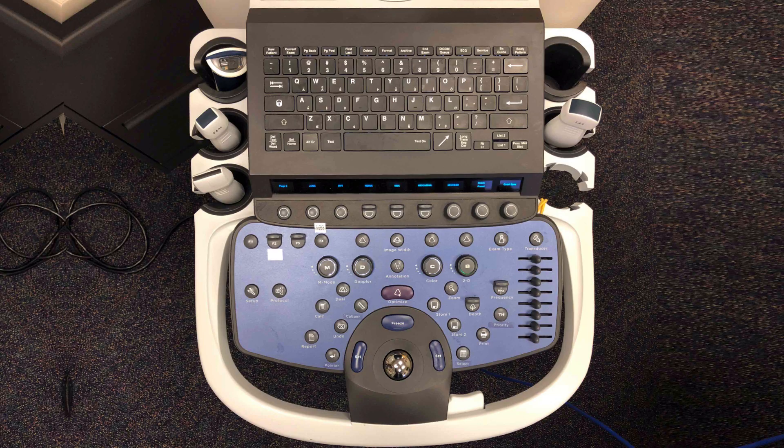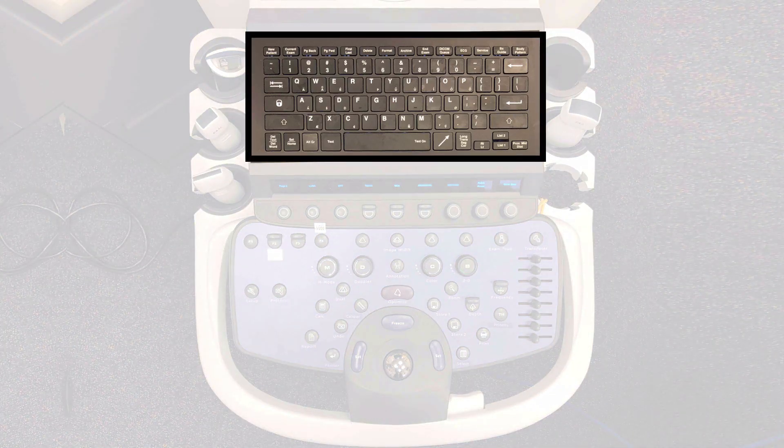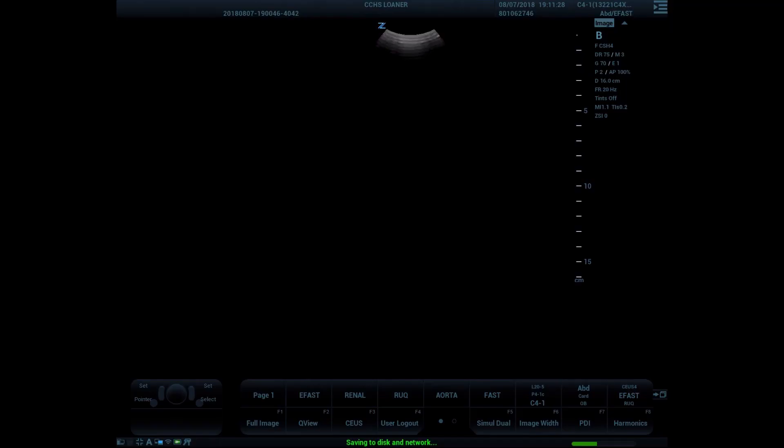This is an overhead view of the keyboard and control keys for the ZS3. The QWERTY keyboard is at the top for entry of information and text. There are OLED soft keys below the OLED display that change based on function. The second row are the function keys. On the 9.0 software, the screen displays the menu indicators at the bottom of the screen to show what the OLED soft keys and function buttons are programmed to do.